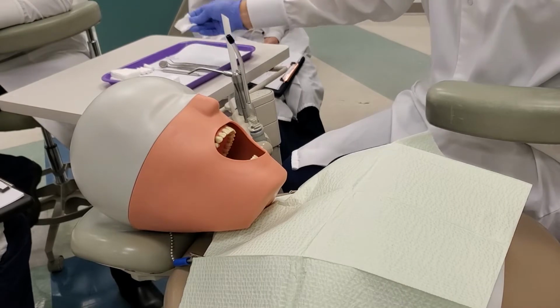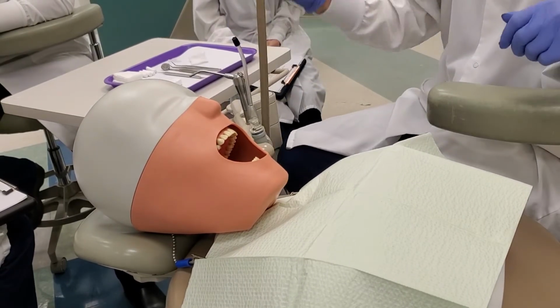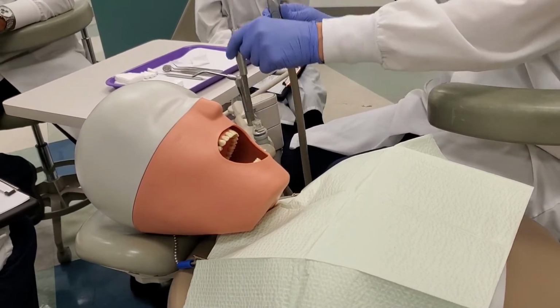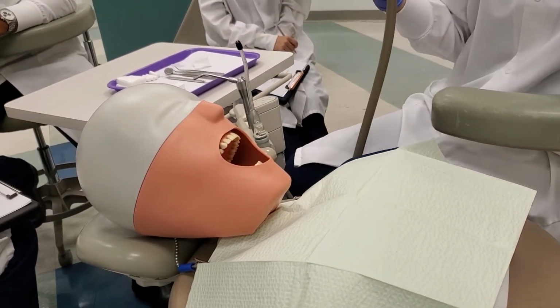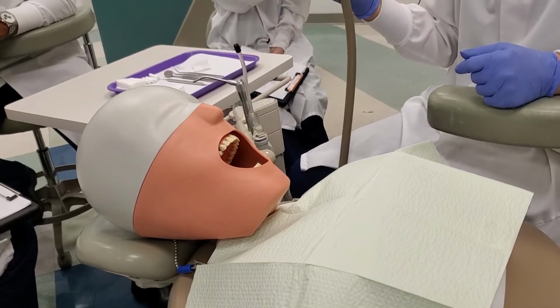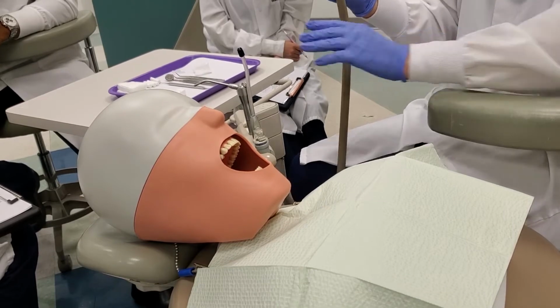Then you're going to pick up the HVE in your right hand. So see how, when you're lifting them up, these will flop out or whatever. So that's why you always want it facing you. So pick up the HVE in your right hand and turn it on to use it, and then use it to retract the cheek on the client's left side.